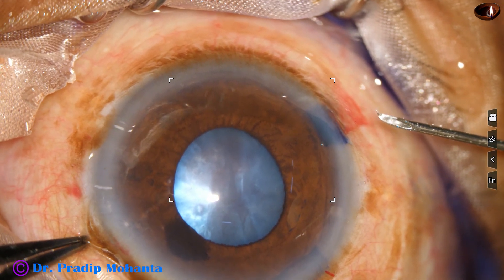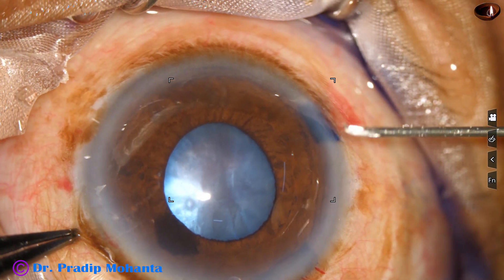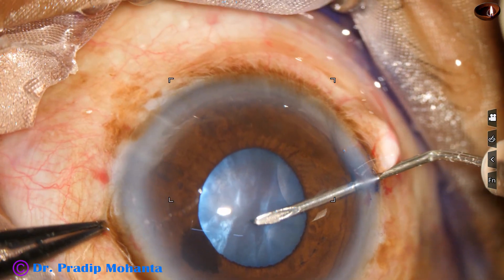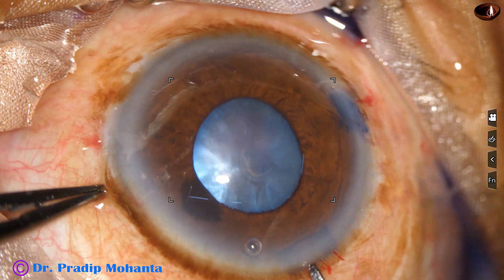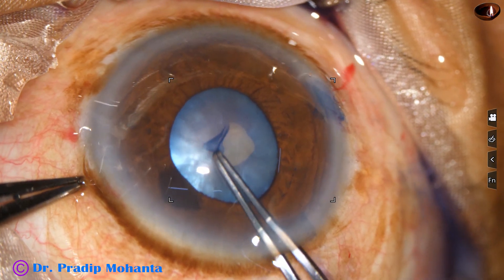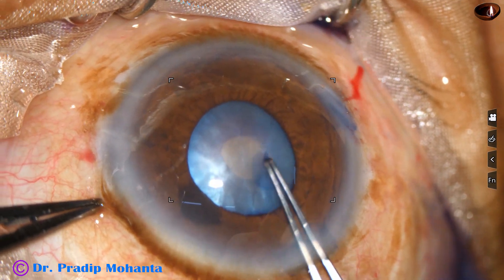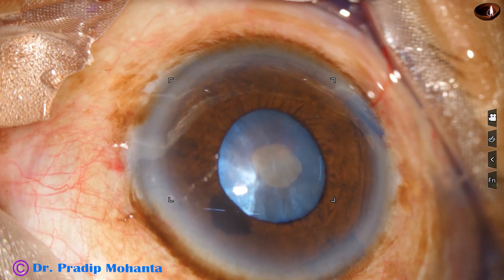Here goes a 26-gauge bent needle. This is a cystotome, and the anterior capsule is punctured at the center. Then the C-flap is converted into a small rhexis. This is not a round rhexis, but it doesn't matter — we are going to enlarge this rhexis anyway.